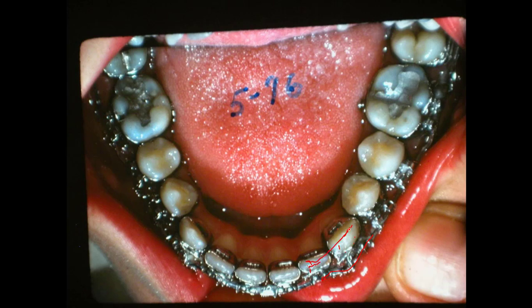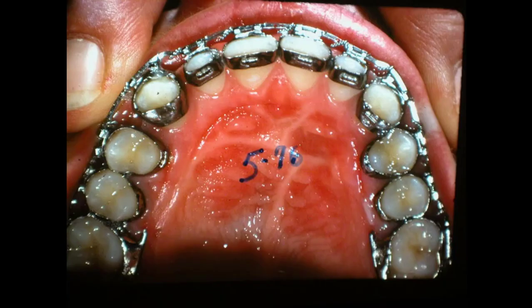We wanted the incisal edges to line up all down here. Now this is the lower arch, so the upper fits over this, and the lingual cusp — where the upper goes down and just grooves right there sometimes. Now we'll look at the upper part. We've got some space up here, so we're going to bring this together and do some finishing. We need to rotate this cuspid a little better.